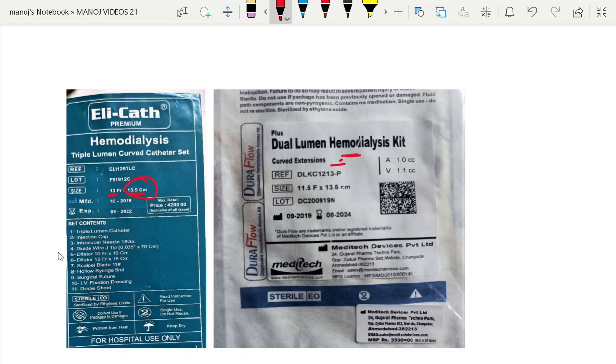Here also dilator is 12 French, it is equivalent to the catheter size. This is the commonly used double lumen IJV catheter, the size is 11.5 French and length is 13.5 centimeter.